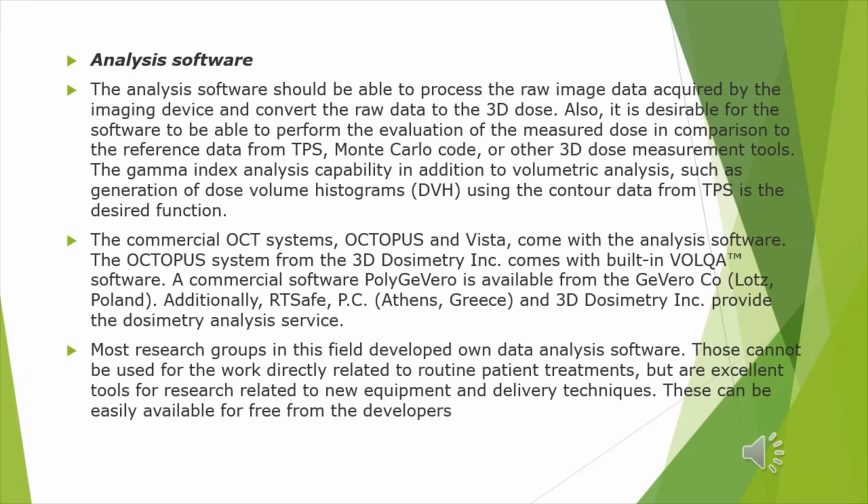The commercial OCT systems, Octopus and Vista, come with analysis software. Most research groups in this field developed their own data analysis software, which thus cannot be used for work directly related to routine patient treatment, but are excellent tools for research related to new equipment and delivery techniques. This can be easily available for free from the developers.